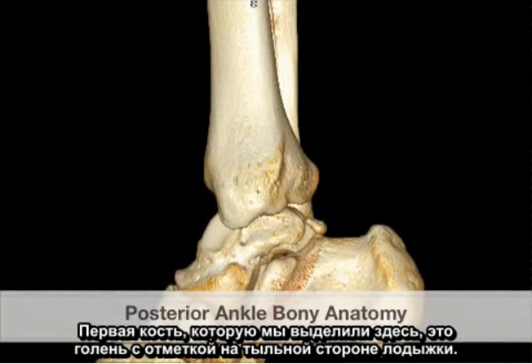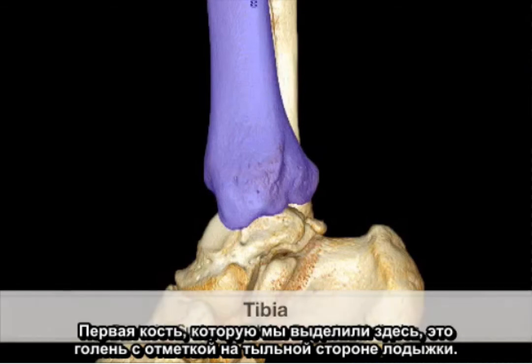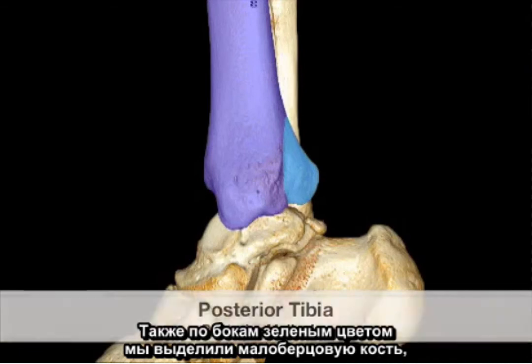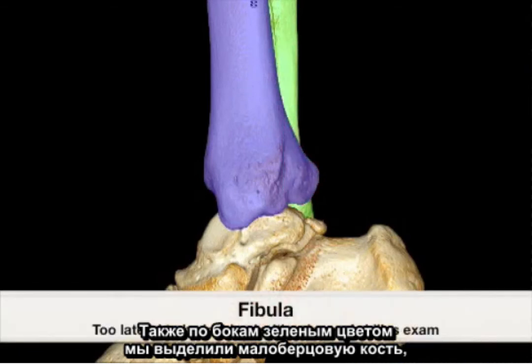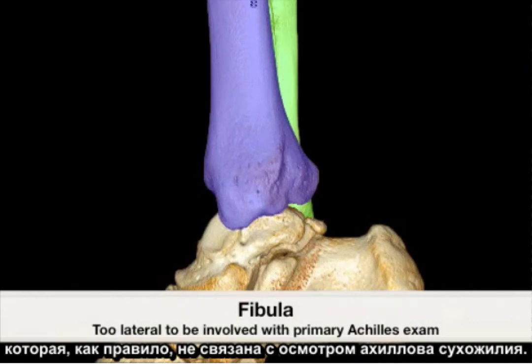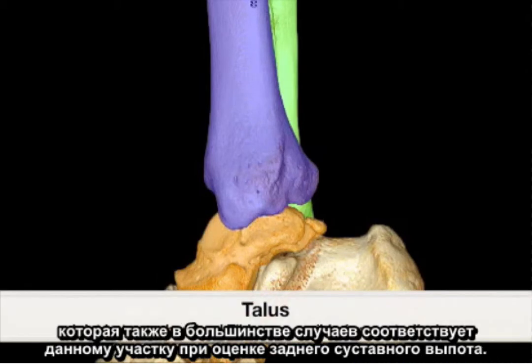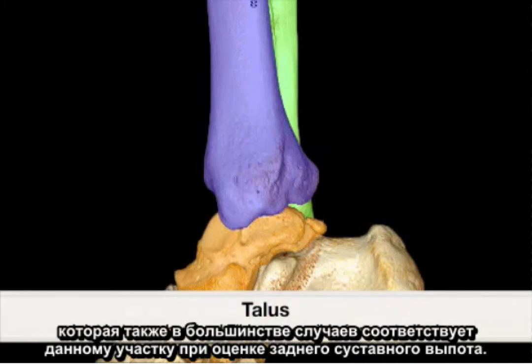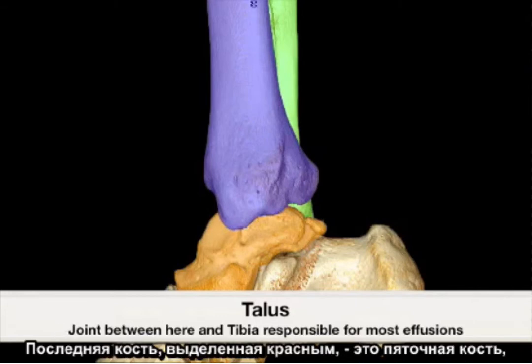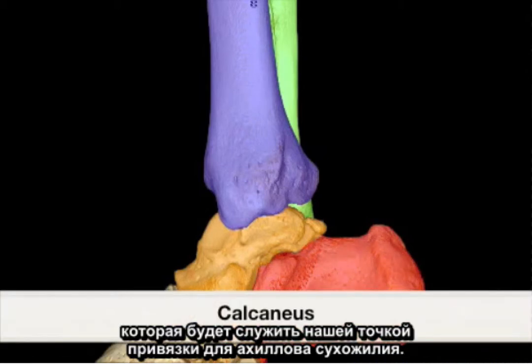The first bone highlighted is the tibia with the posterior landmark of the posterior malleolus. Laterally in green, we have highlighted the fibula, which is typically not associated with the Achilles tendon examination. Highlighted in orange is the talus bone, which is responsible for evaluating most posterior joint effusion. The last bone highlighted in red is the calcaneus, which will serve as our anchor point for the Achilles tendon.